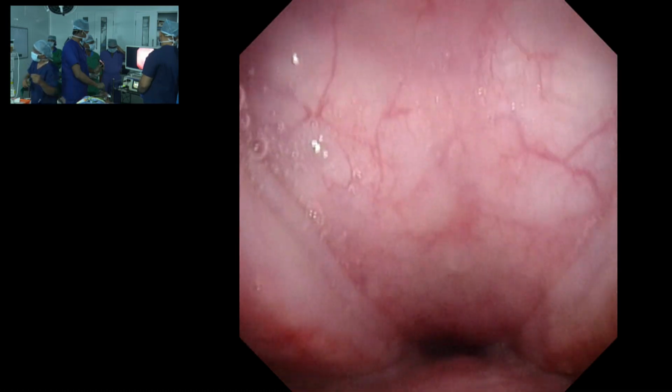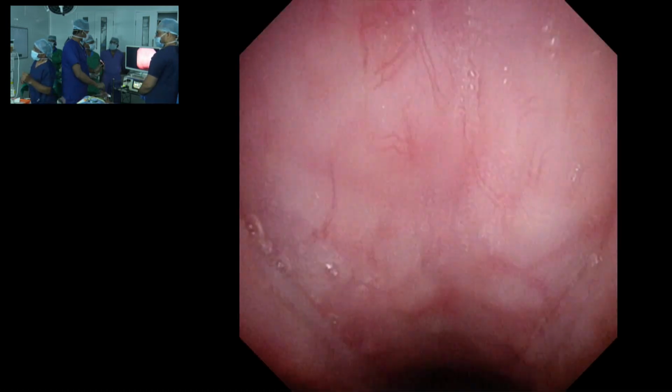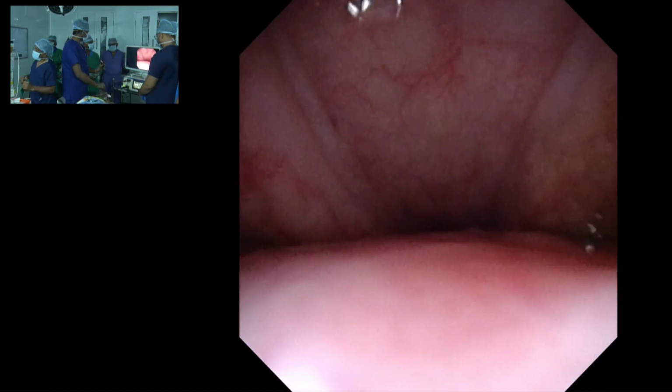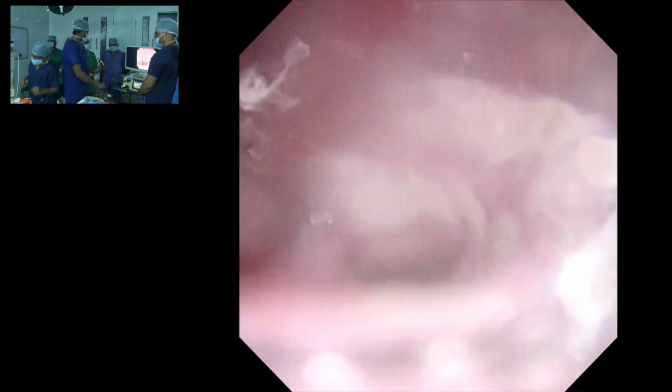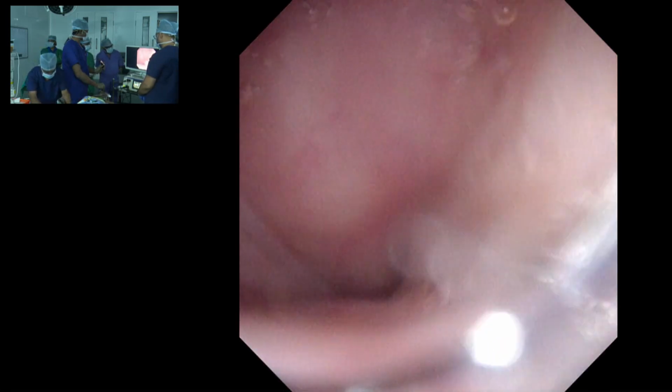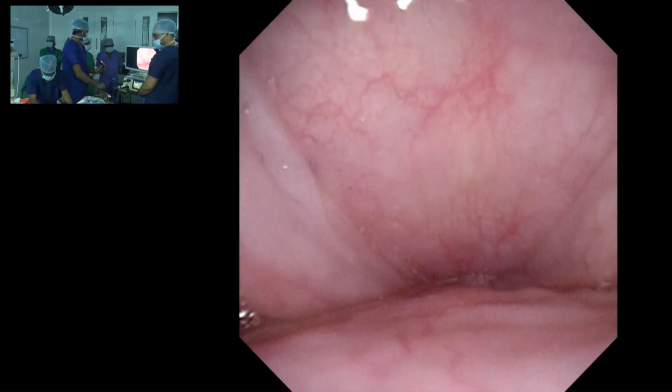and the patient is in an apneic episode. So you can see the vibrating palate. It's showing a nice anteroposterior collapse. So you have to at least wait for 3-4 cycles of apnea before concluding the pattern of collapse.